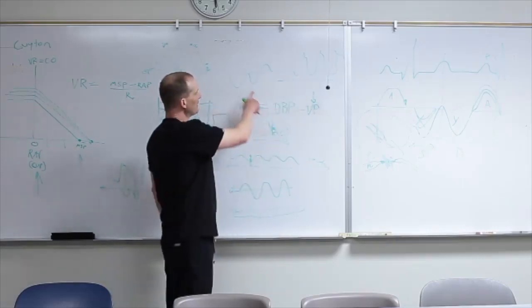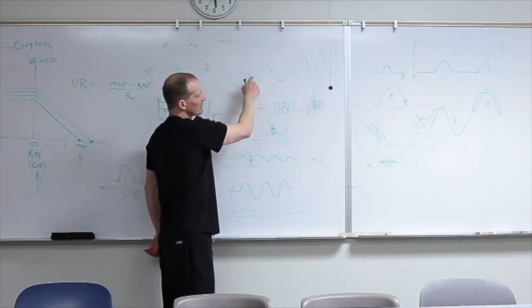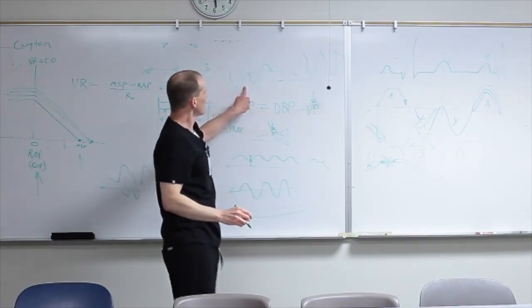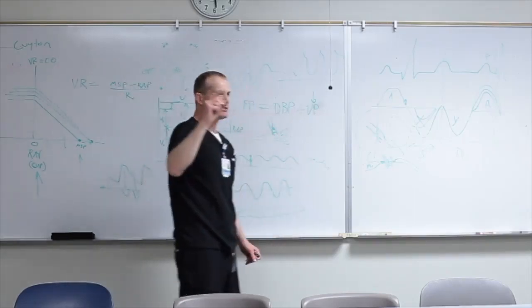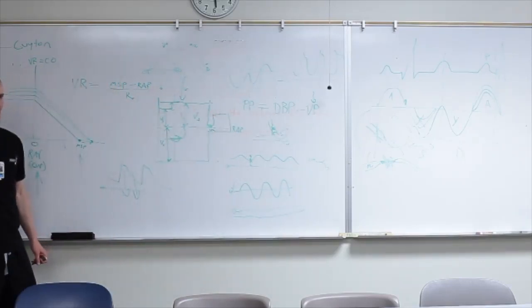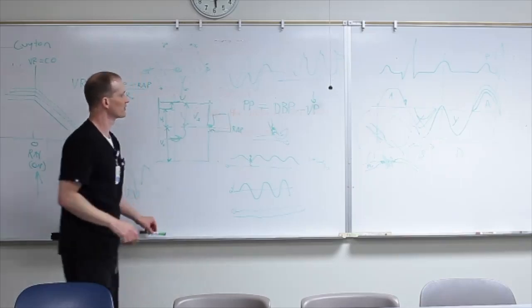If this was a biphasic pattern, like sometimes happens with the hepatic vein, you're not going to usually get it confused with the portal vein because it's nowhere near it, and the vessels are different sizes. The portal vein is wrapped in peritoneum-type tissue, so it has a bright wall, and hepatic veins, you can't see the walls. So it'd be a little more difficult to confuse those.